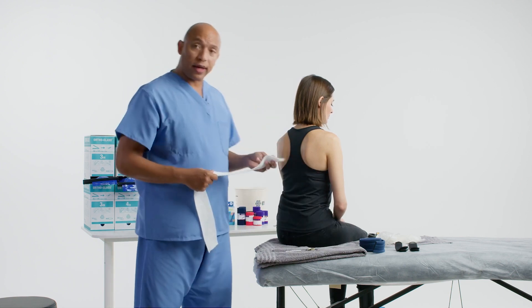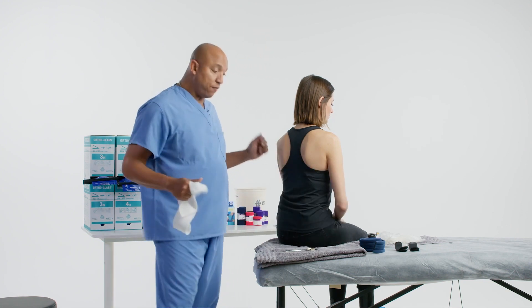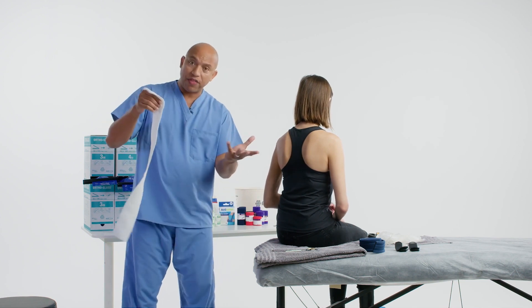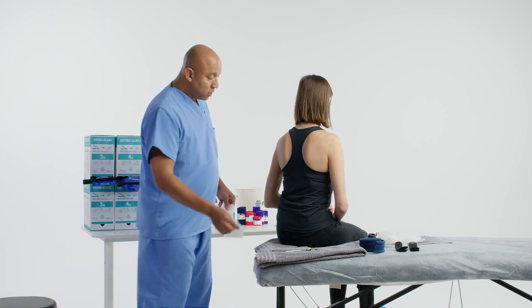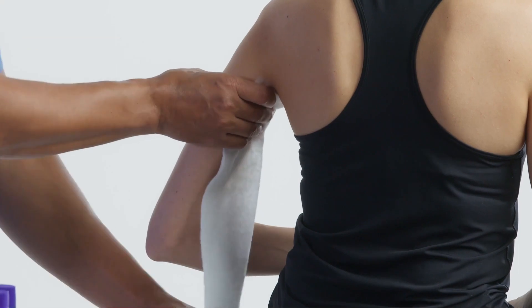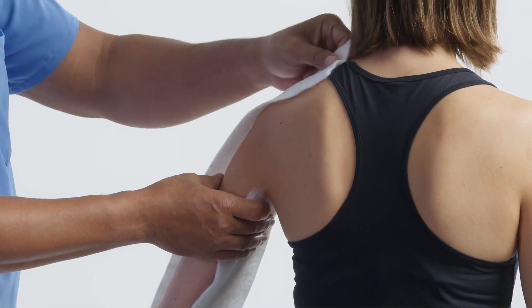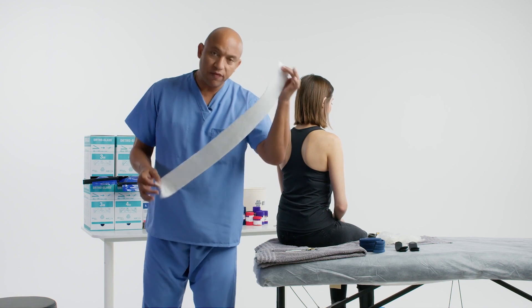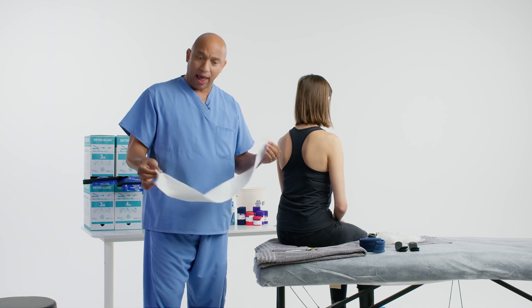When we get ready to measure for this, we're going to measure from the actual area all the way around, and we use the unaffected side. I'm going to go in the armpit here, and you can use a tape measure or padding of your choice, and go all the way over to the AC joint. This is my measurement for the ortho glass — and the same applies whether you're using ortho glass or another substrate like plaster.